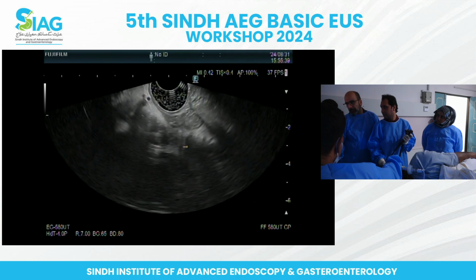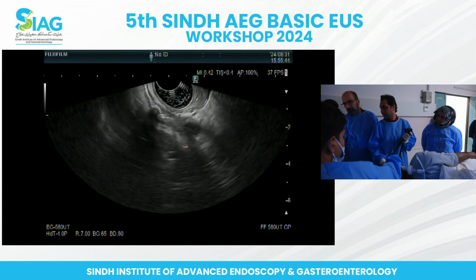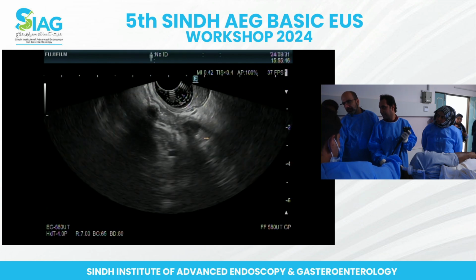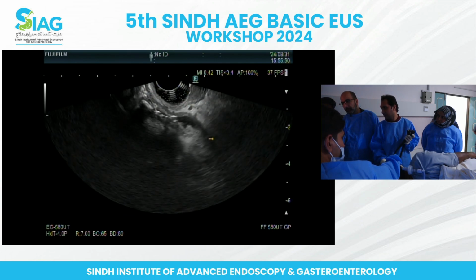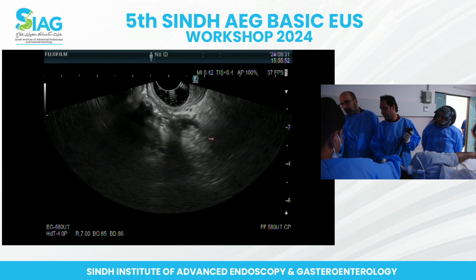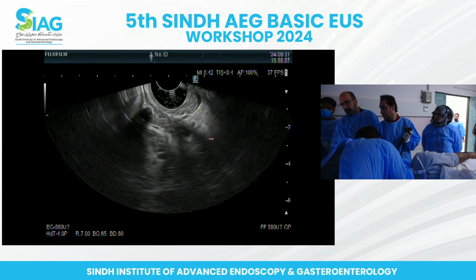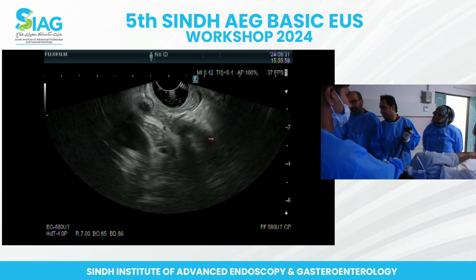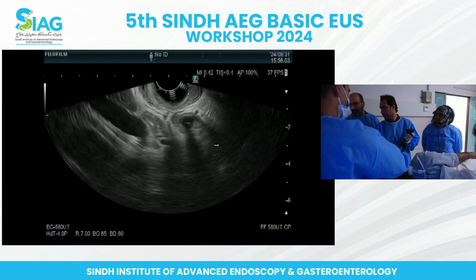And you have to push forward to try and maintain it. And it's going off to the right here. So see if you can follow it down to the right. Sometimes you can't. So big wheel towards you. There you go. Good. Keep going clockwise. Keep going clockwise. And maintain that view. So yeah, there you go. Good. Keep going down. Big wheel towards you.